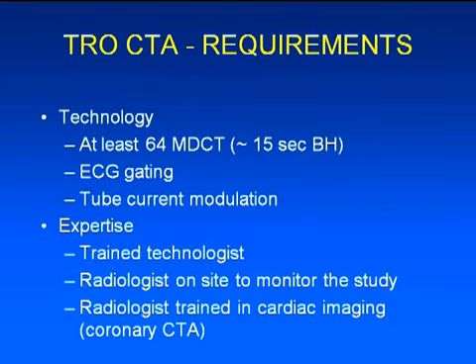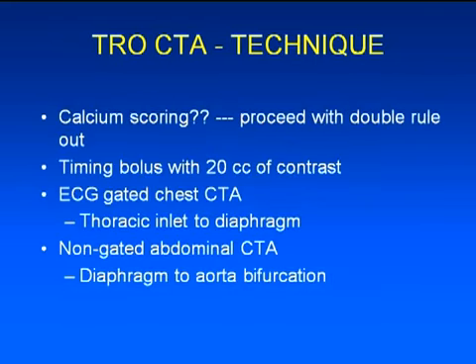You need a trained technologist, and you need a radiologist on site to monitor the study most of the time, to help the technologist prep the patient and so forth. And you need the radiologist to be trained in cardiac imaging to look at the coronary CTA part of the study.